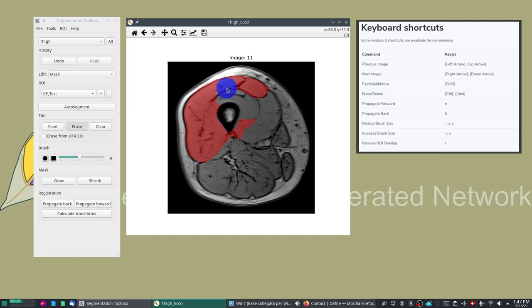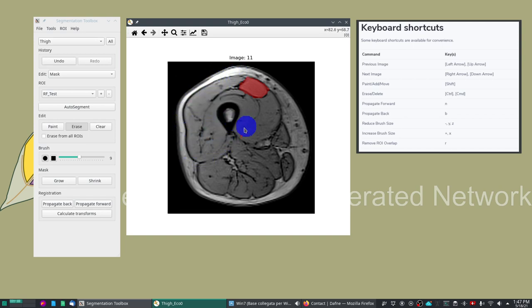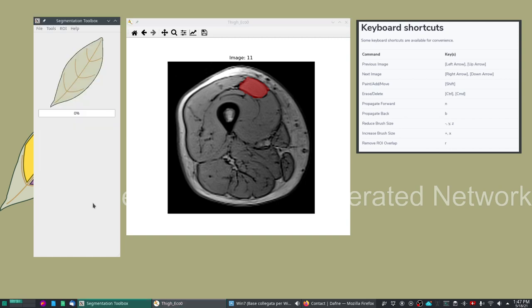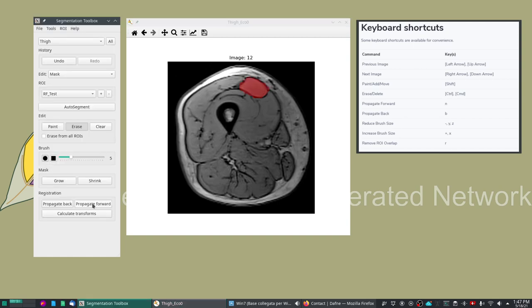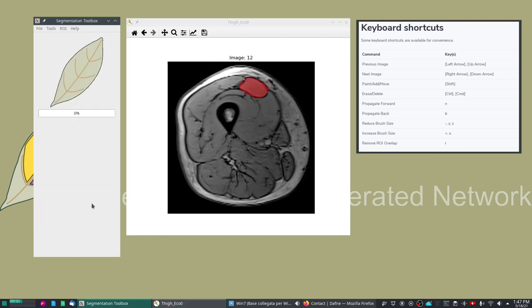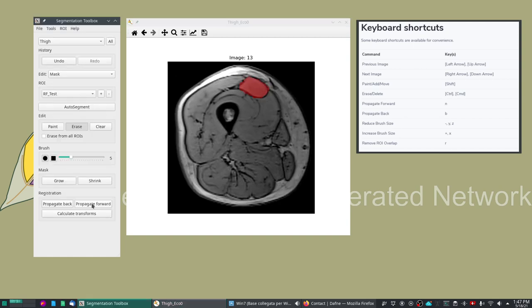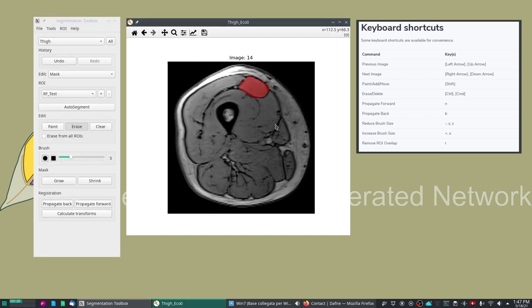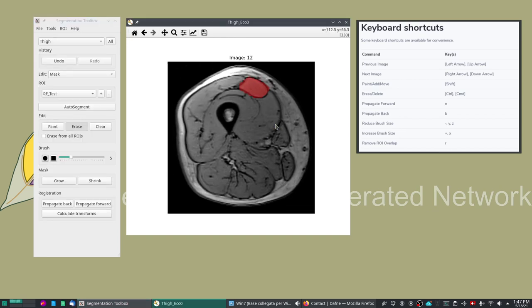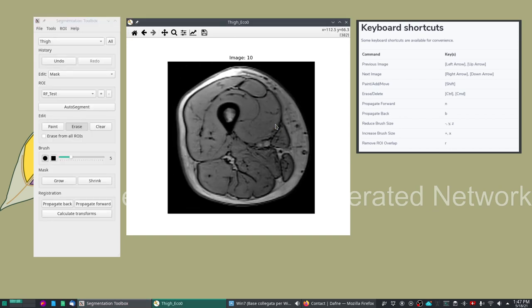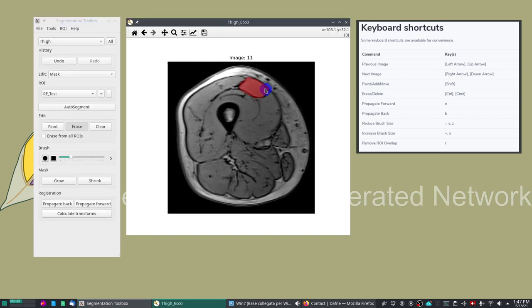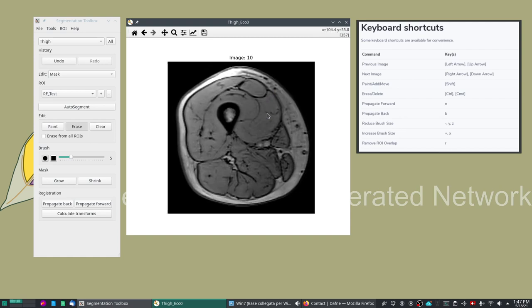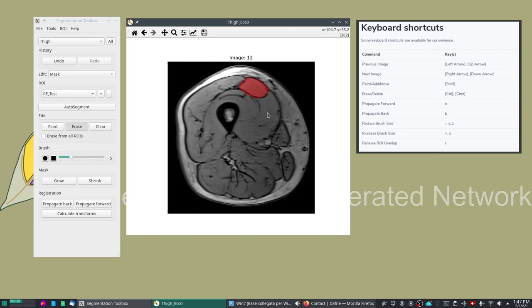Let's now go back to just having the rectus femoris in this ROI and I will demonstrate the last feature of this interface which is the propagation of the mask or of the contour to neighboring slices. We can use the N and B buttons or the propagate forward and propagate back.